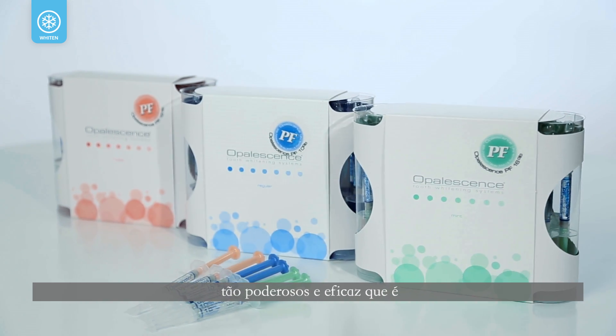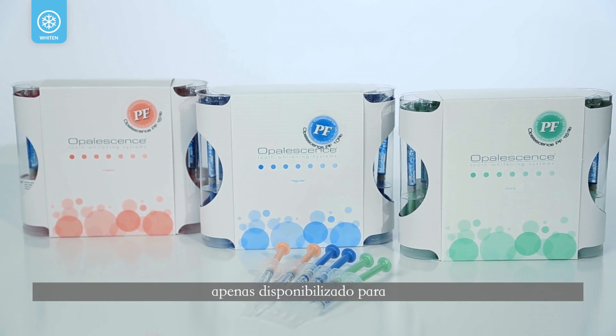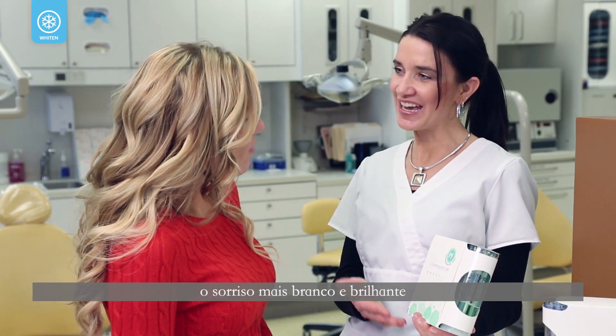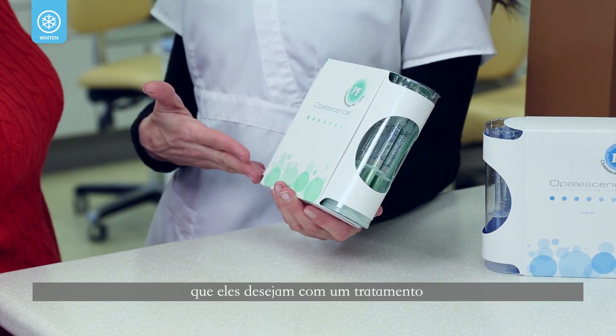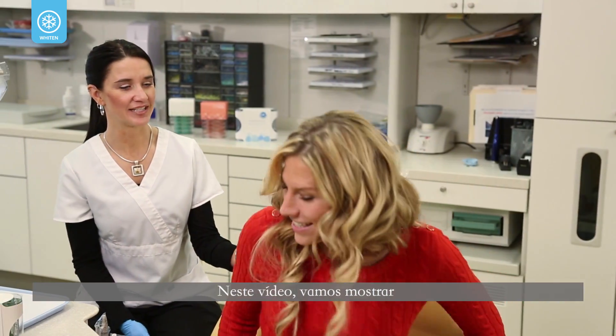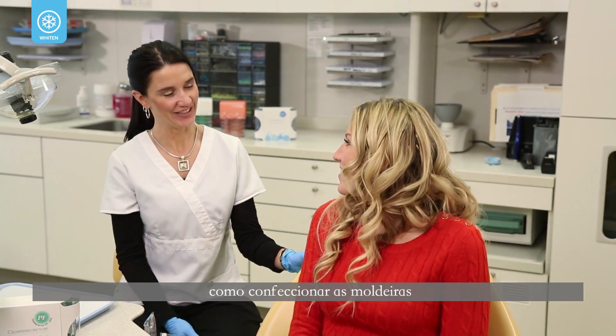Opalescence is a professional whitening treatment so powerful and effective, it is only dispensed by dental professionals. With Opalescence, you can give your patients the brighter, whiter smiles they want in a treatment that fits their unique needs. In this video, we'll show you how to fabricate custom whitening trays and how to begin a whitening treatment.